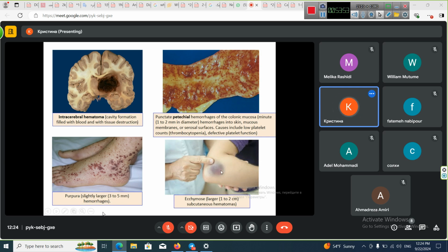in diameter. So what we see is the blood which came from blood capillaries, and it is seen now from above.